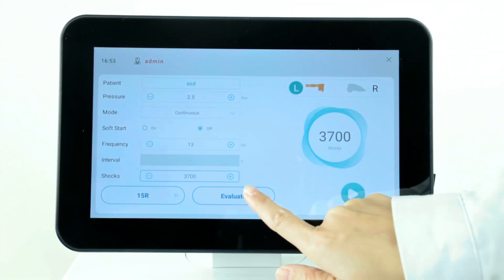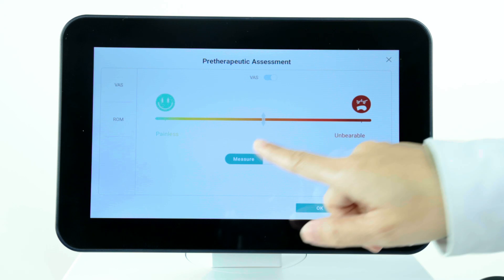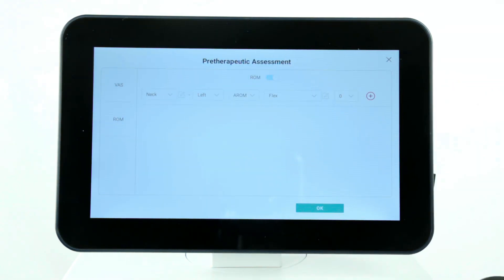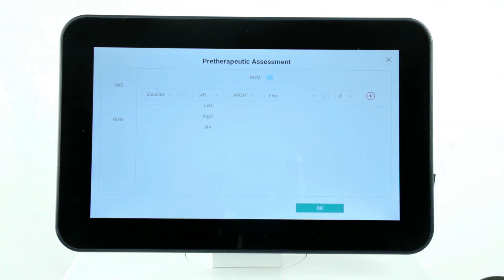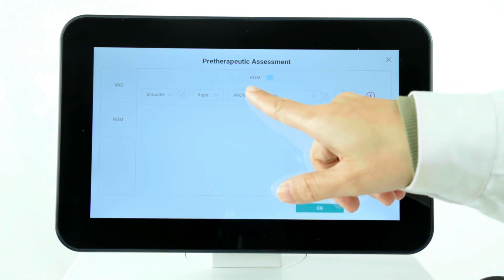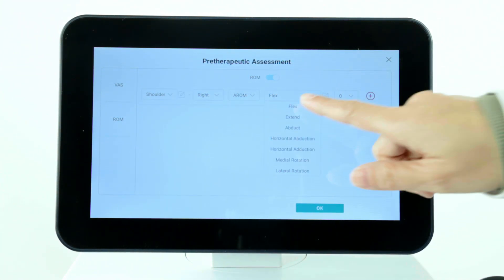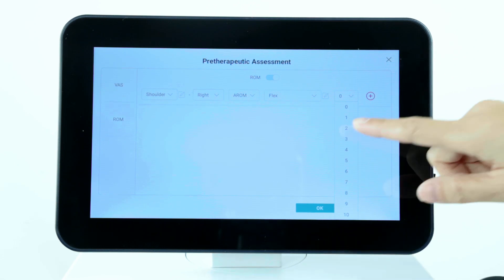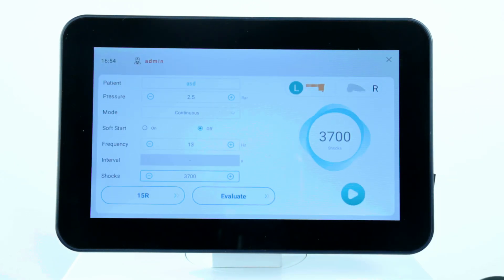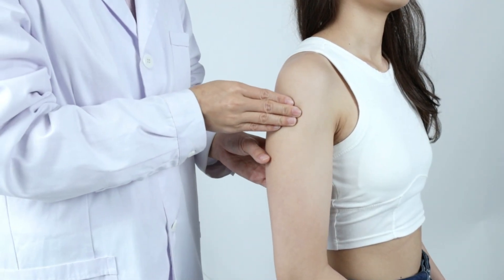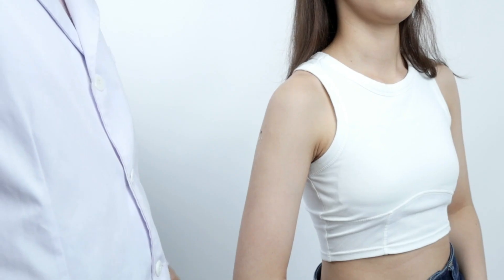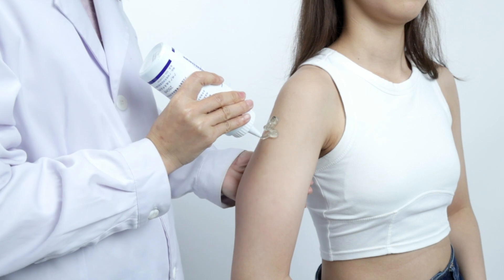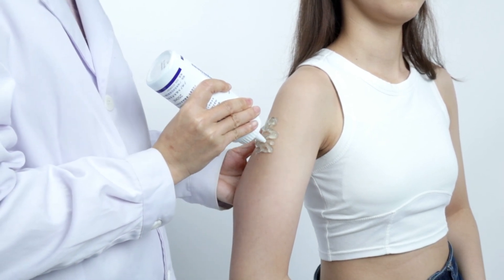Click Evaluate button. You can evaluate the pre-treatment pain and mobility conditions of patient for comparison after finishing the treatment session. Before clicking the start button, locate painful spots using palpation. Then apply a generous amount of gel to the treated area. The gel helps improve the transmission of shock waves and ensures maximum effectiveness.